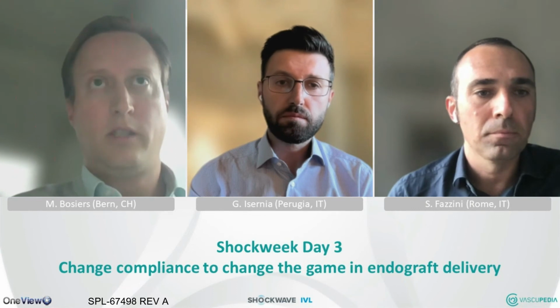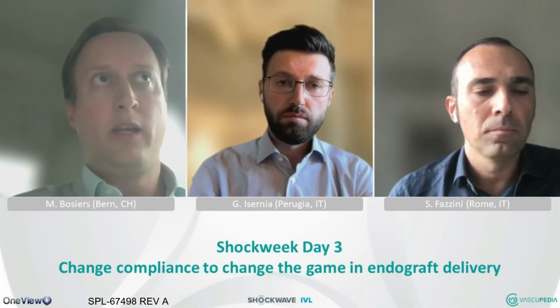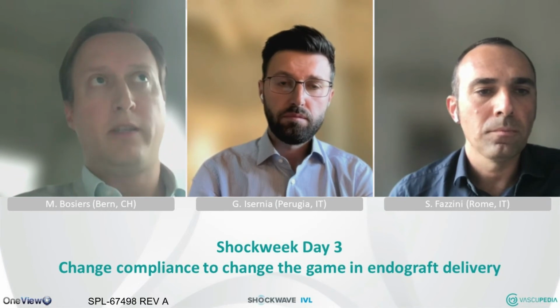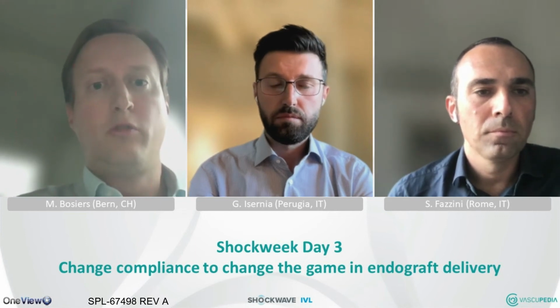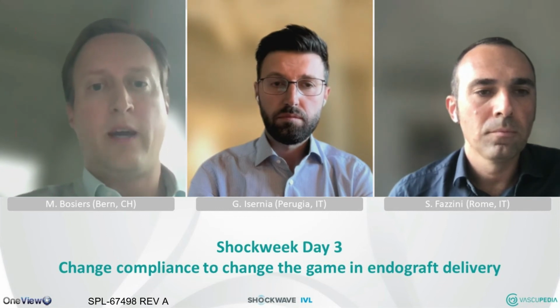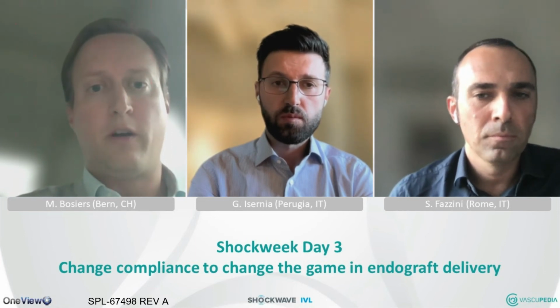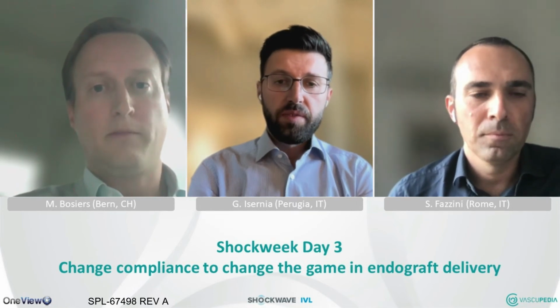Other question: since you've been using IVL, how many iliofemoral bypasses or endoconduits, Stefano, you just mentioned one case, or any kind of other therapy did you need to perform since starting to use IVL? In my experience, I've had 0 open or endoconduits so far after starting to use this device. What about you guys?